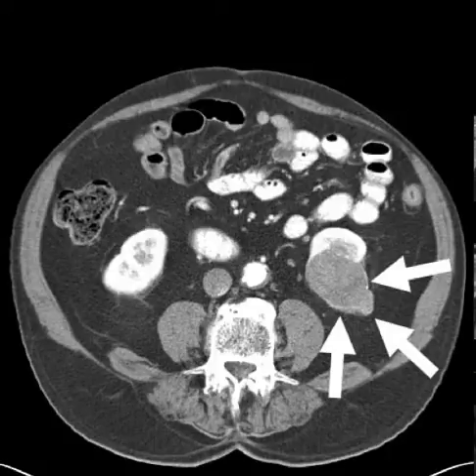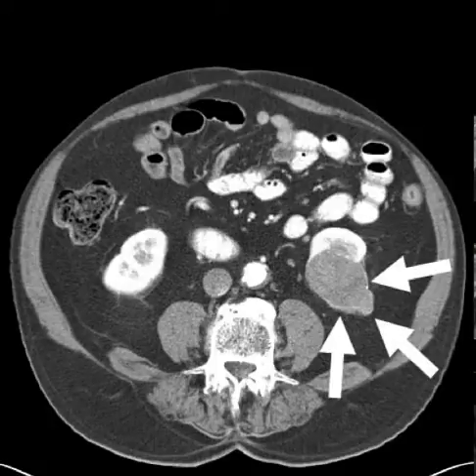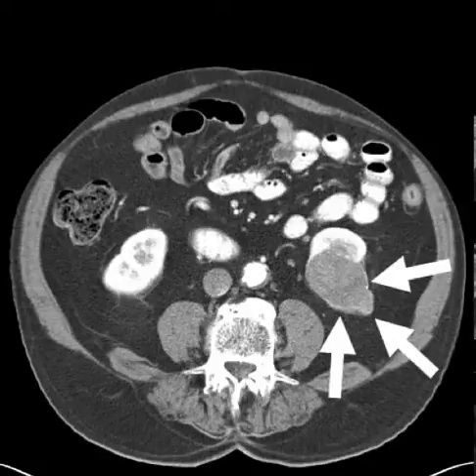As far as papillary carcinoma, since the nephrographic phase is more sensitive, we're going to see it there. But also because the papillary one doesn't tend to be as vascular as a regular clear cell carcinoma, we're going to be able to see it on the corticomedullary phase. So that's an earlier phase, and since that phase, we're already seeing something that makes us suspicious for a renal mass, and that's going to be most likely a papillary type of carcinoma. And that's one of the reasons, based on those factors, we can start getting more knowledge about the histology that's going to be the final result for this tumor.